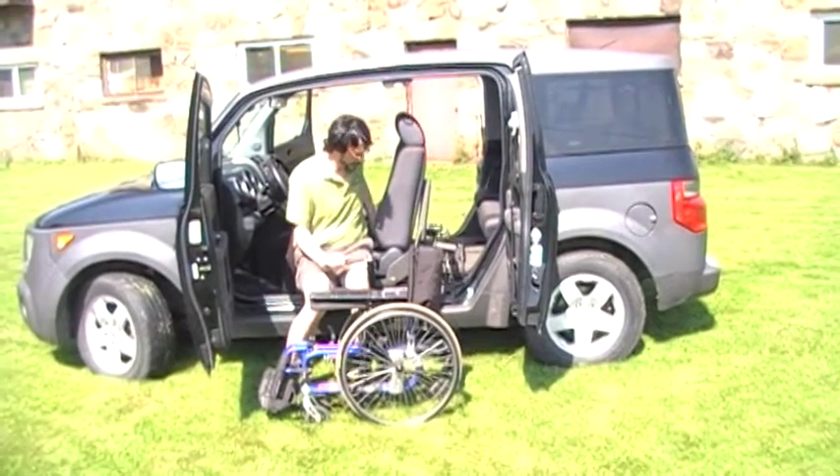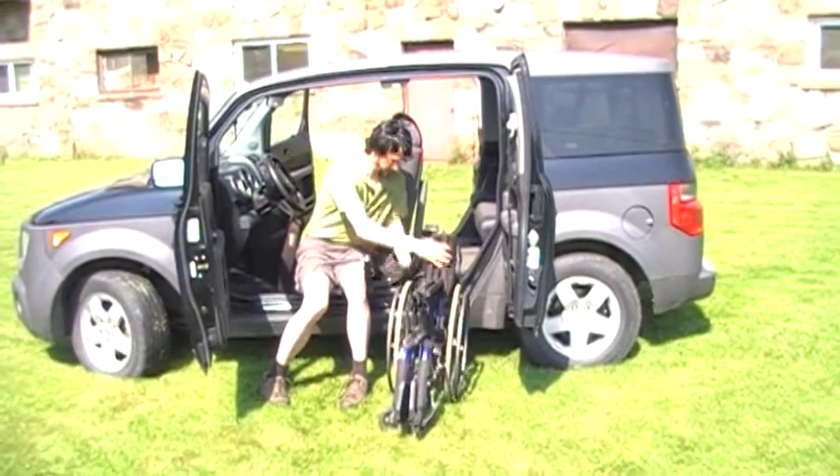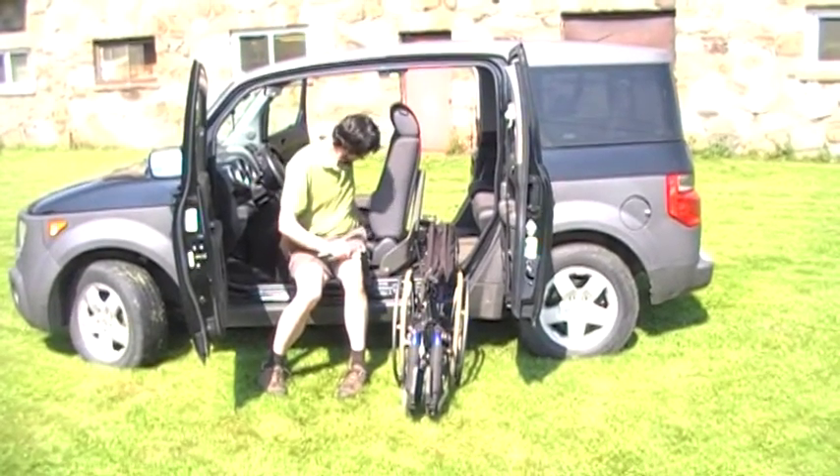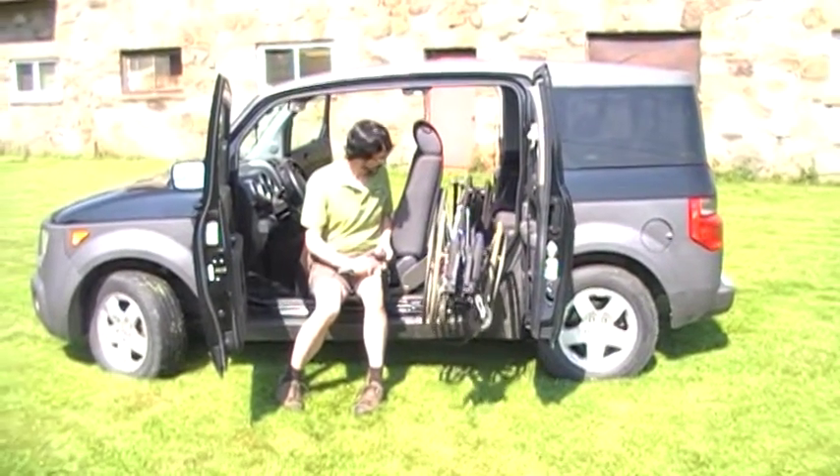Once the Easy Stow MI is in the down position, we connect the wheelchair, raise the wheelchair up, and in it goes.